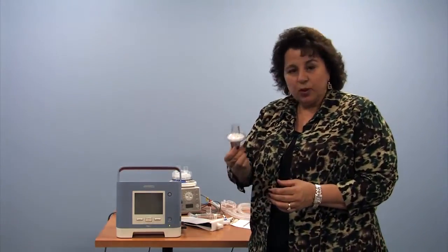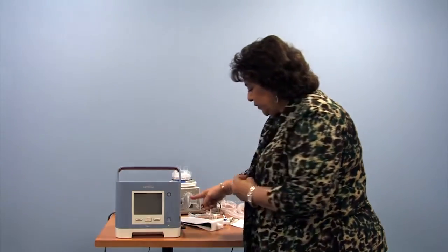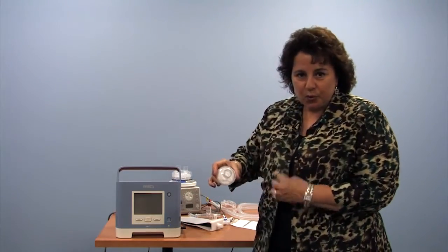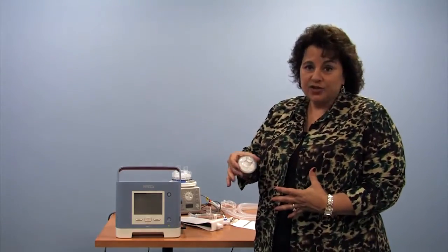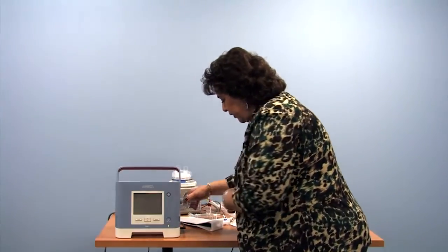The majority of the durable medical equipment companies do like you to use a filter on the outlet of the gas flow. This filter is changed typically weekly or every 2 weeks, but keep an eye on it because it can turn dark, and it has nothing to do with the cleanliness of your home. It may have to do with the type of heating system or if the windows are open and it's allergy season. So just keep an eye on this. If it gets dark, change it and let the company know if you need more than they provide for you.